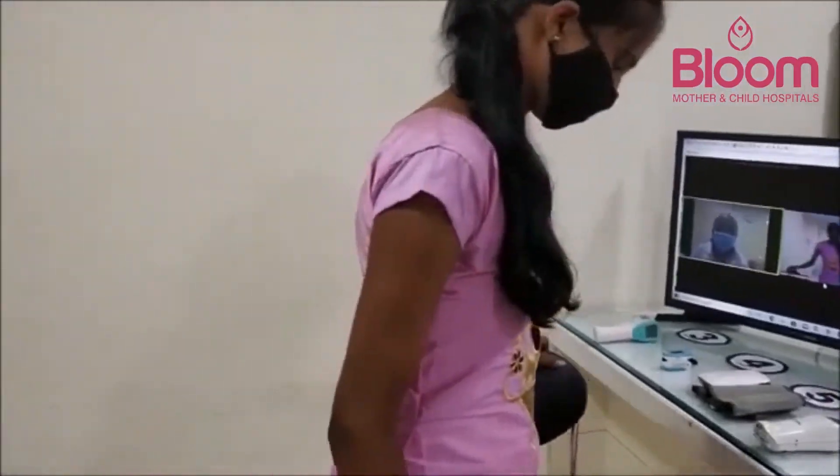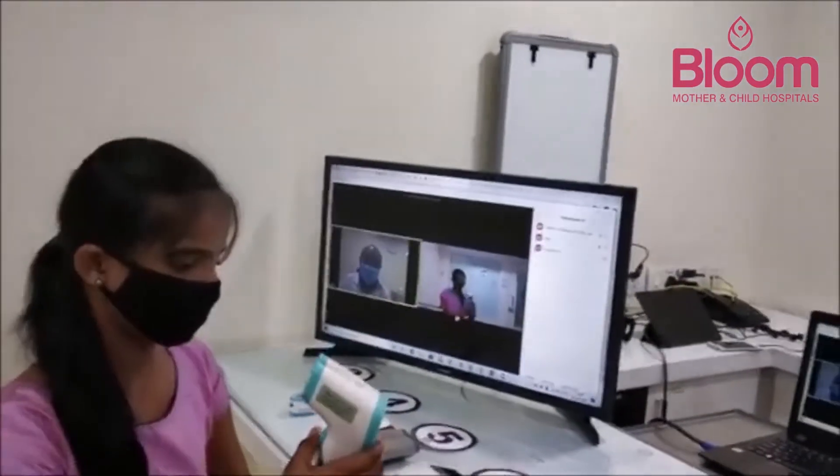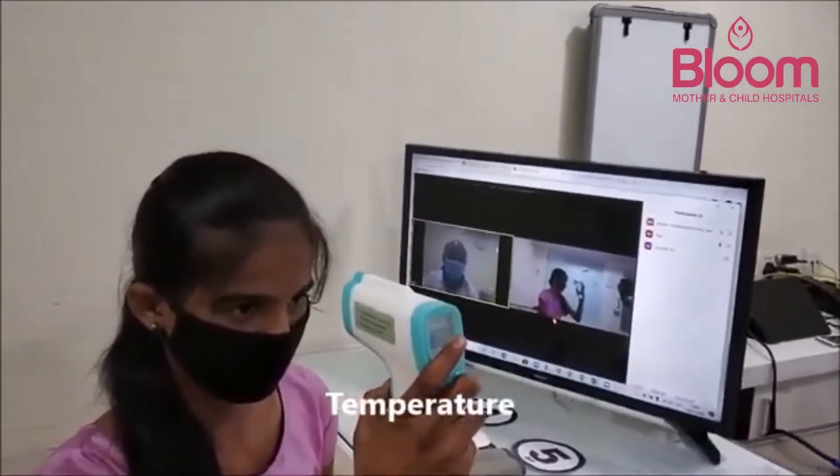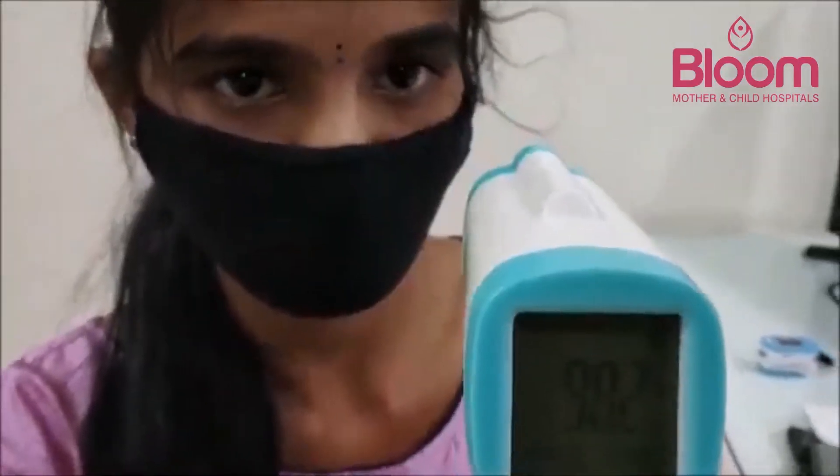The patient proceeds to station three for temperature measurement. The infrared thermometer records a temperature of 98.2 degrees.